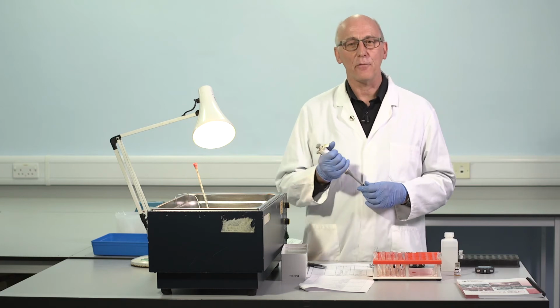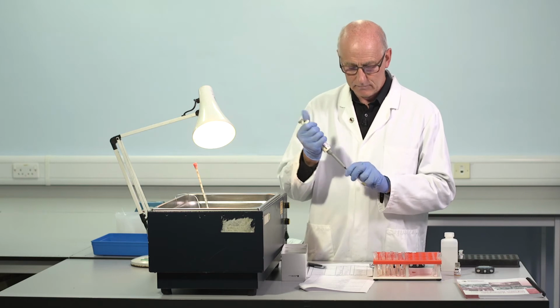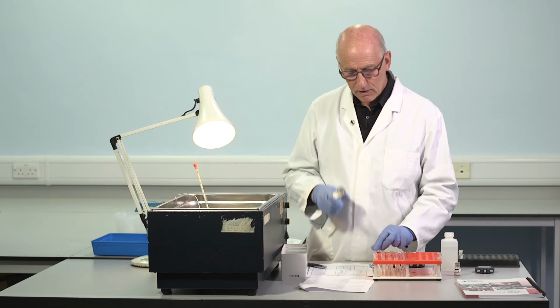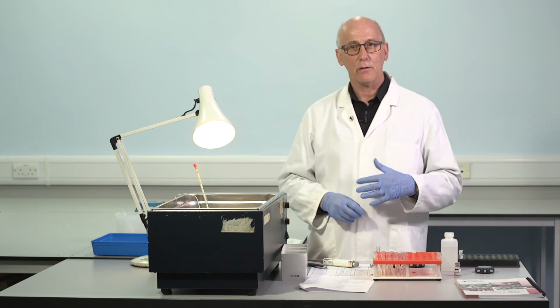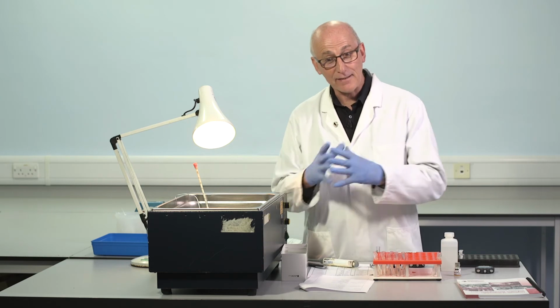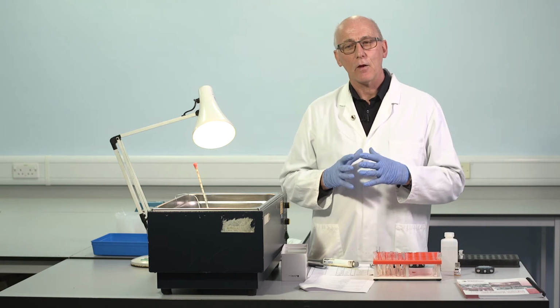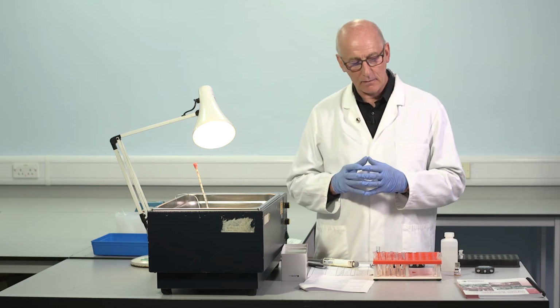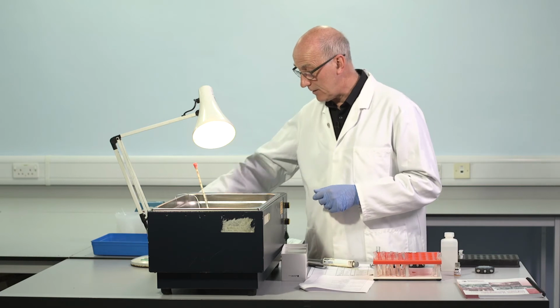And how do we obtain that information? We start with the same factor VIII deficient plasma, 100 microlitres. Just a single tube. And remember, for all the previous tests, we made 3 dilutions of test, standard, QC, and we added that to the 0% factor VIII, the factor VIII deficient plasma. To look at the clotting time for this assay system in the absence of any added factor VIII, we simply add the dilution buffer now to the factor VIII deficient plasma.